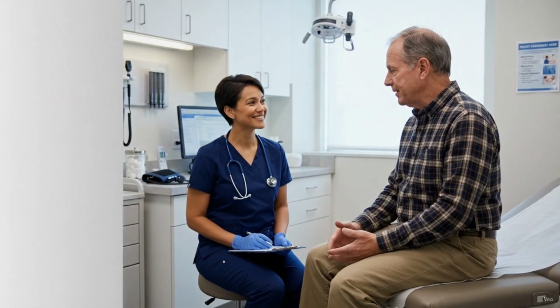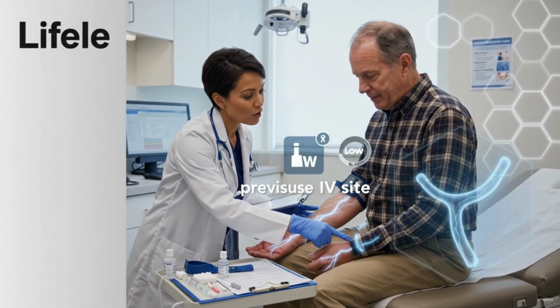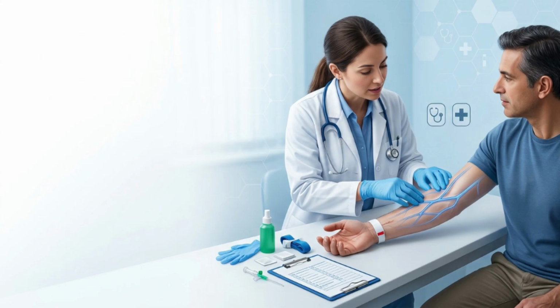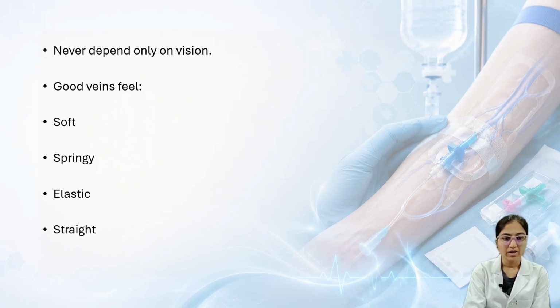Next, vein assessment. We need to look, feel, tap gently, palpate, and then assess elasticity. Never depend only on vision. Good veins feel soft, springy, elastic, and straight.